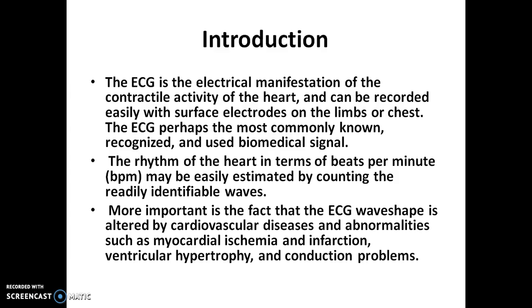So first of all, what is ECG? ECG is monitoring of the electrical activity of the heart. Because in the heart, some electrical activity is going on for the chambers to contract for pumping the blood. If you plot that electrical activity in the form of a signal, that is called the ECG signal. It can be recorded by placing surface electrodes on the limbs or chest. And ECG is perhaps the most commonly recognized and used biomedical signal.